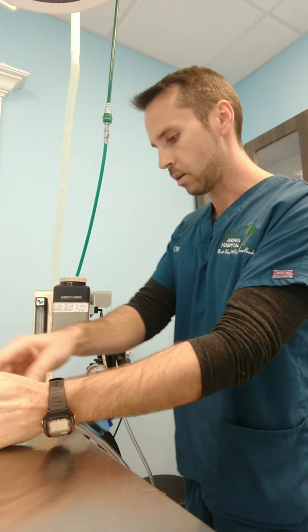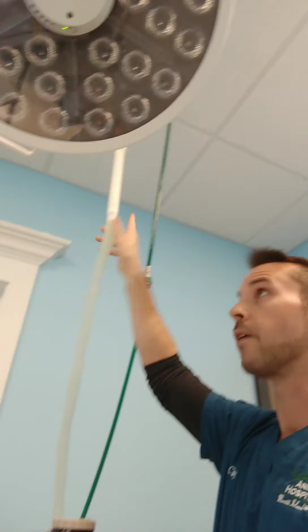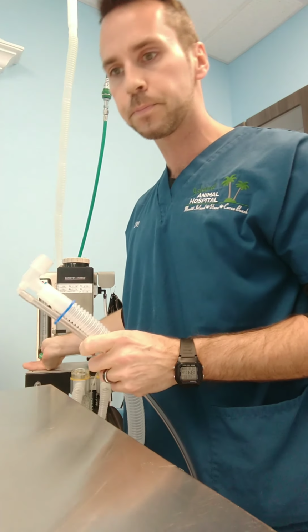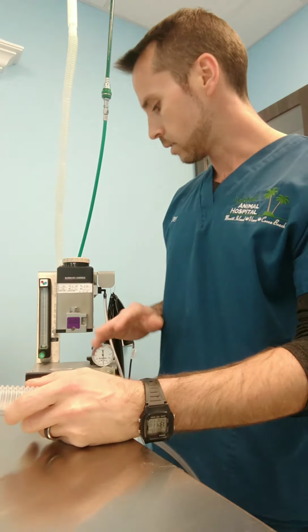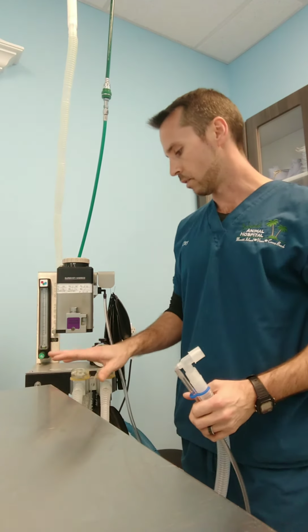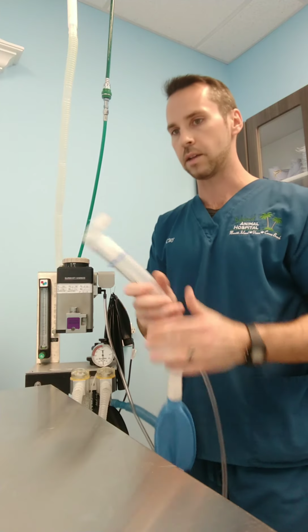So once they exhale, it goes through to this tube, and it goes down to our scavenging system, which is down here. And then that sends it up through this tube out of the building. So the difference between the non-rebreather and the rebreathing system: the exhaled carbon dioxide does not return to the patient, so we don't use the CO2 absorber. We bypass the flutter valves, so the patient just inhales the gas directly.